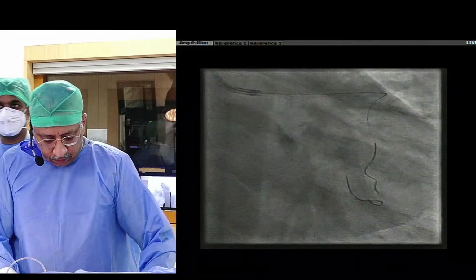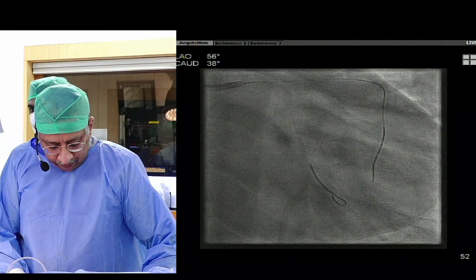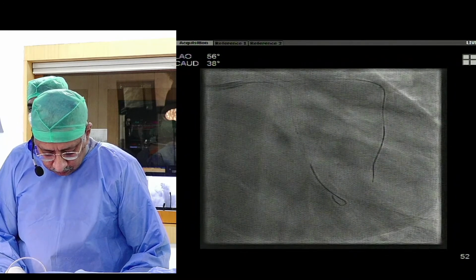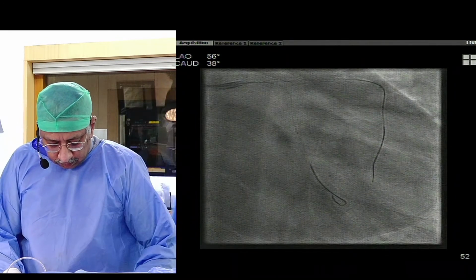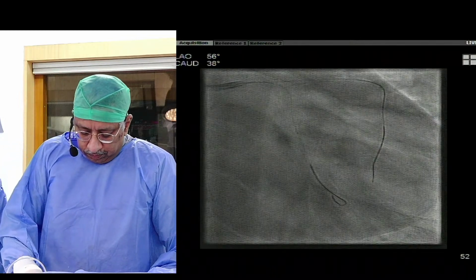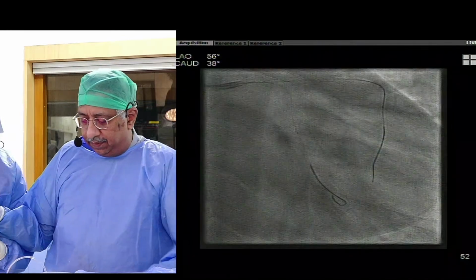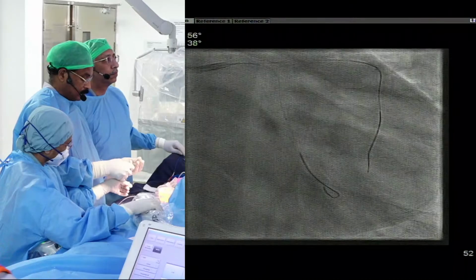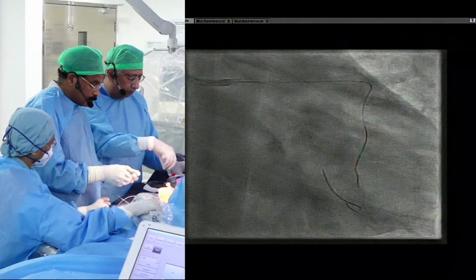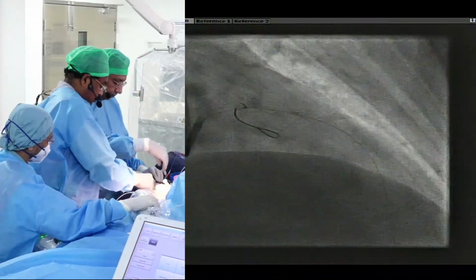Which catheter do you have available to you? Do you have OptiStar now, Ronnie? No, we've got the Optis with us. So, in the past, one of the problems with the Optis was it was a little bit floppy and had difficulty as a rapid exchange getting to the circumflex. The OptiStar is really a major advancement. It's a lot more sturdy, shorter rapid exchange and easier to track into the circumflex. So hats off to the engineers who made a significant leap by helping us with the catheter.